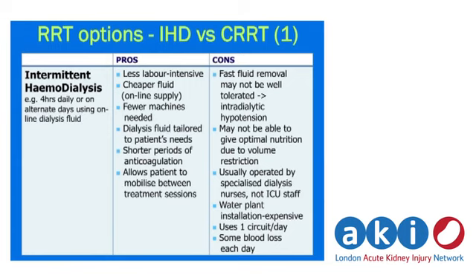Traditionally, certainly in the UK, intensive care nurses aren't trained to use those dialysis machines, and when intermittent hemodialysis was used in critical care, it was always a matter of the dialysis unit nurses coming in and operating the machines. Whereas these machines were made with the intention, perhaps simpler, that they could be used by ICU staff who have lots of other machines to get to know.